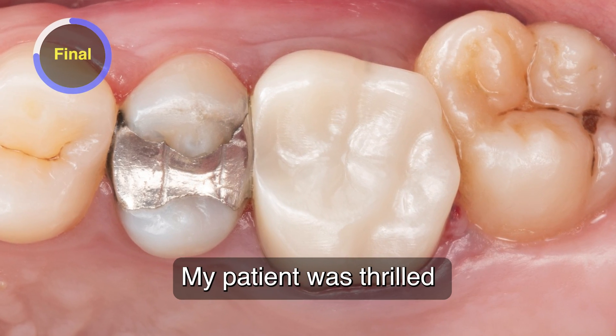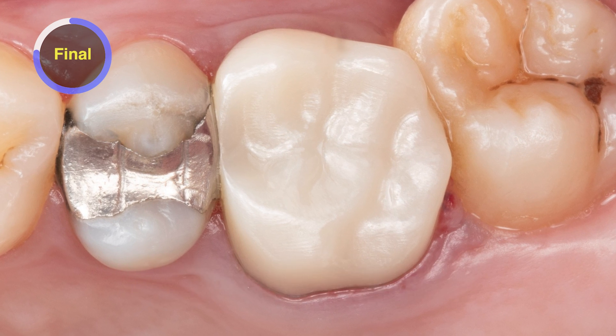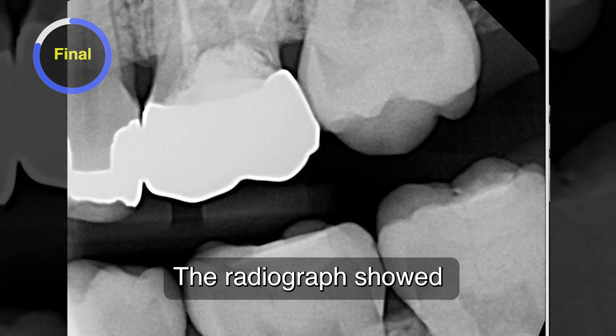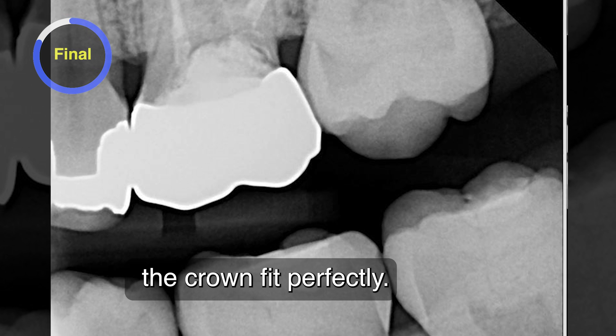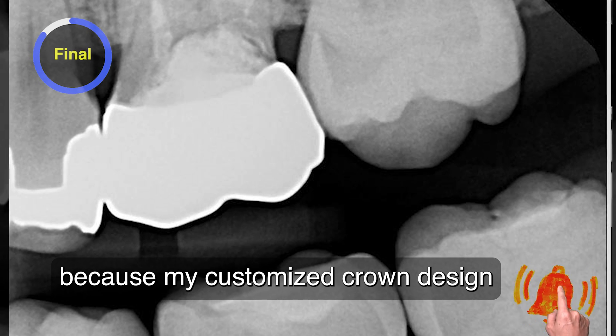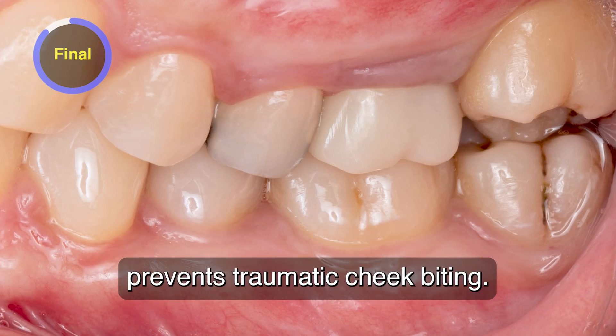My patient was thrilled to have a real-looking tooth and shape for this area. When she returned for her six-month recall, the radiograph showed the crown fit perfectly. Her quality of life improved greatly because my customized crown design prevents traumatic cheek biting.